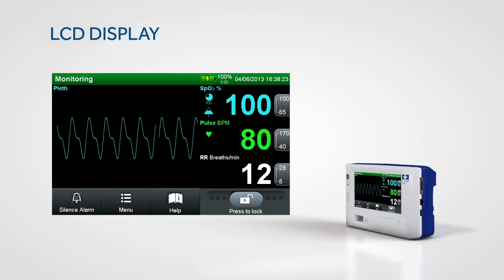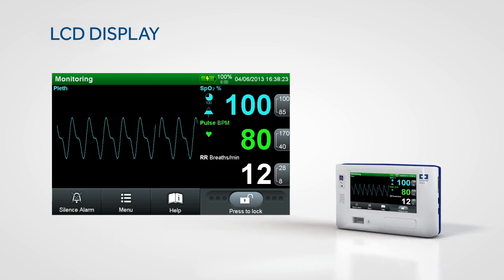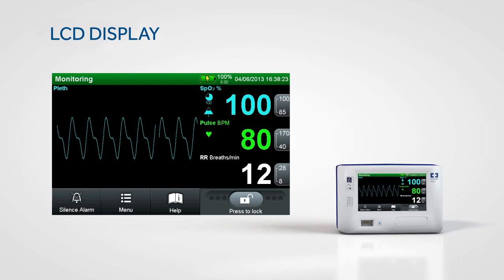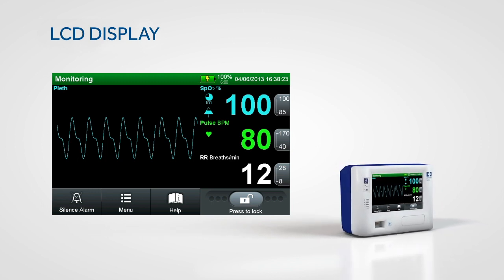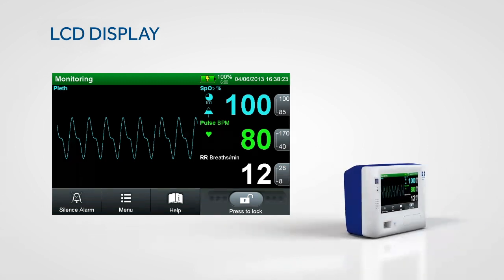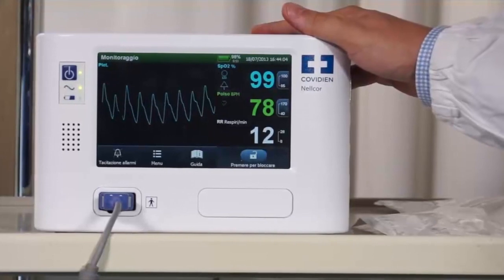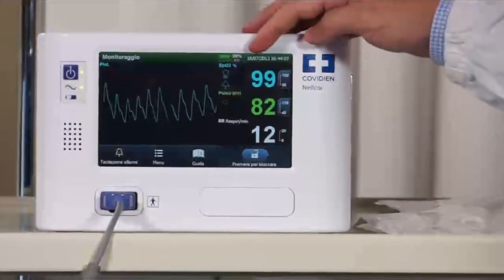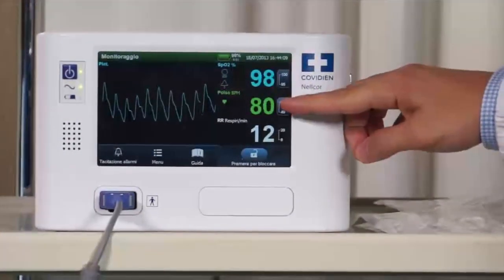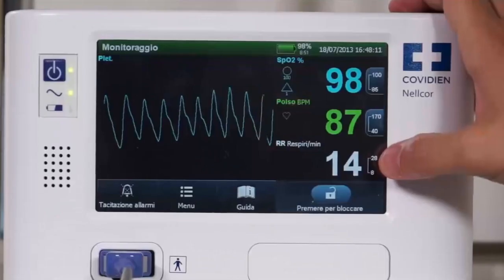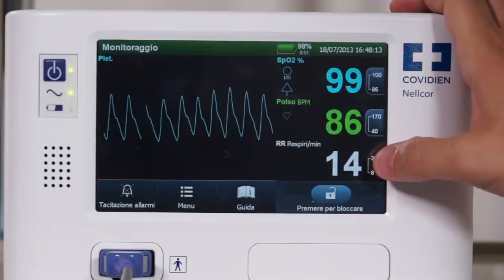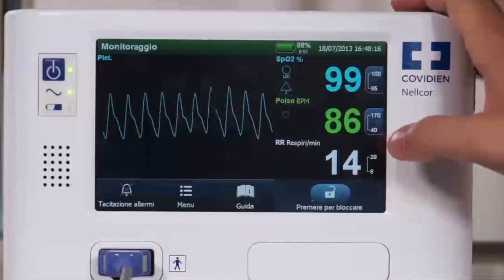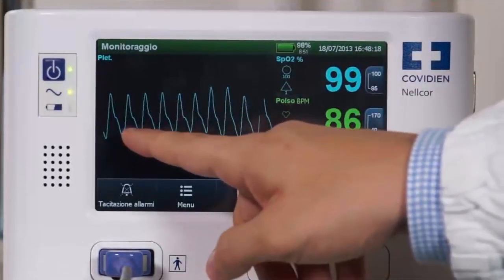The state-of-the-art color touchscreen interface is designed to be both easy to read and easy to use, so you can see critical patient information quickly. Key parameter measurements are displayed prominently, readable from any angle and lighting situation. This readability supports normal workflow in all acuity settings.